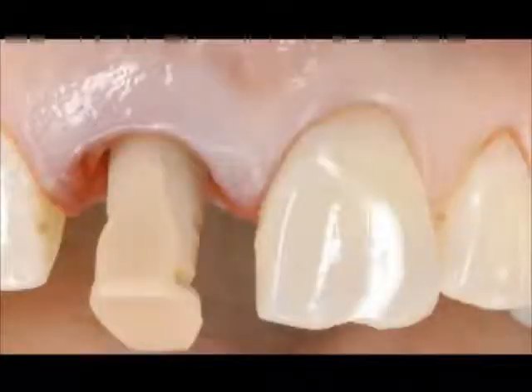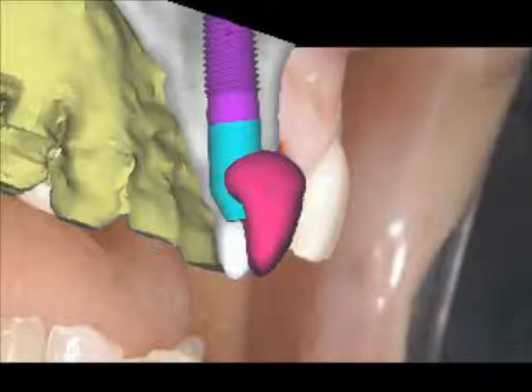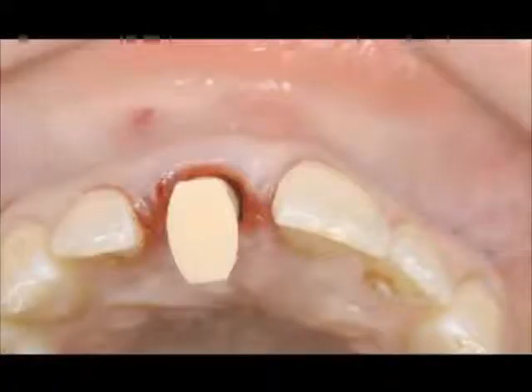This is the day of surgery. You can snap it onto the abutment, and you can send it off to the lab for the fabrication of a temporary, or in some cases even a final restoration. You can see how this was all taken and derived from CAT scan 3D technology.